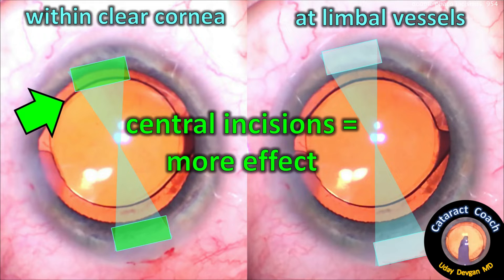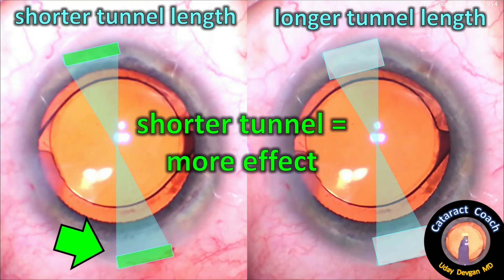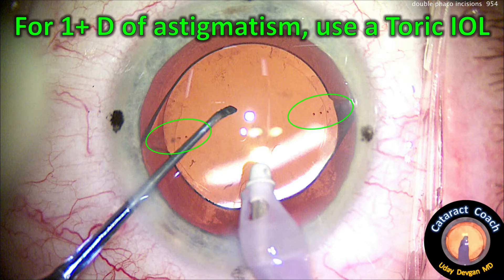The more central the incision, the more effect — though placing it at the limbal vessels gives a bit less effect, is more predictable, and heals better. A shorter tunnel length will have more effect; a longer tunnel length a little less. Be consistent with your incisions. For one diopter or more of astigmatism, use a toric lens — there's no question about that.